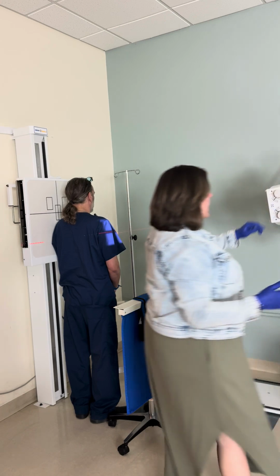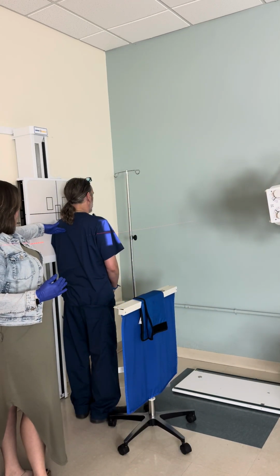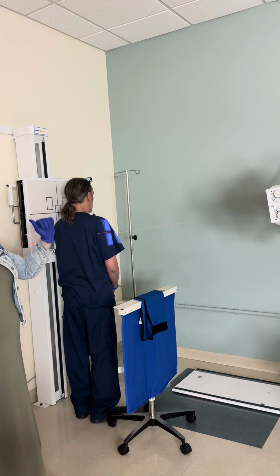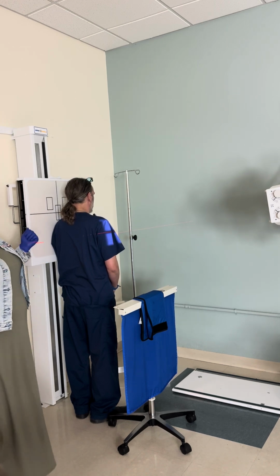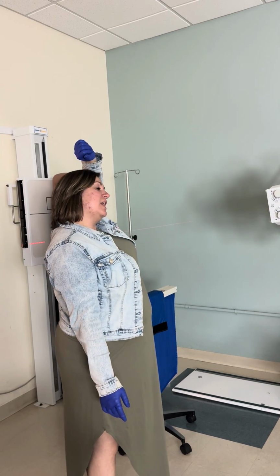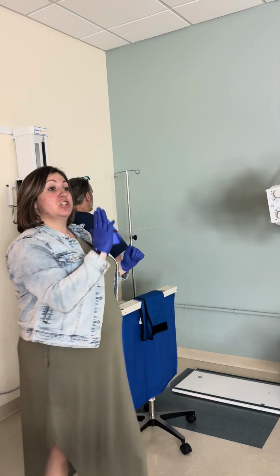And what this does is when we're doing this caudal angle, it helps to slice through between those shoulders, okay? Because that's the point, is we're trying to get between the shoulders to see that portion of the spine. So the book shows the patient bringing their left arm up and over their head. I don't really like this because I feel like the patient ends up tipping the head and you don't end up with your spine straight.